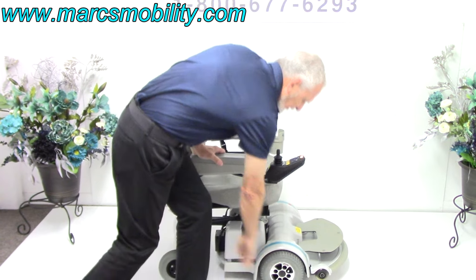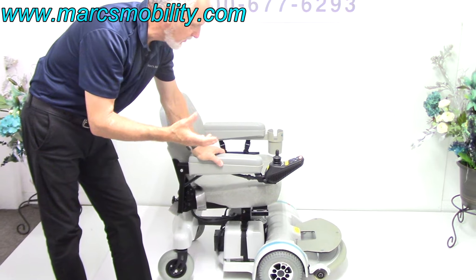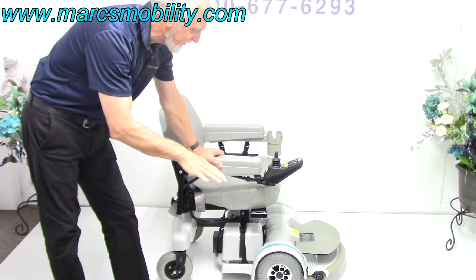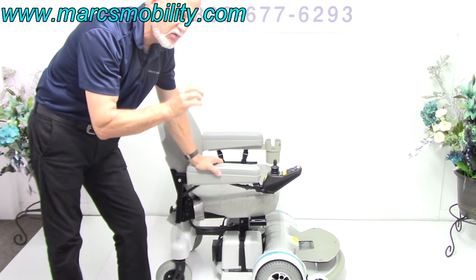All the knobs are on the tires, so it was probably delivered and used maybe for a week or a few days. It's brand new. It does have the 5-inch seat lift in brand new condition, and it has the super heavy-duty motors.